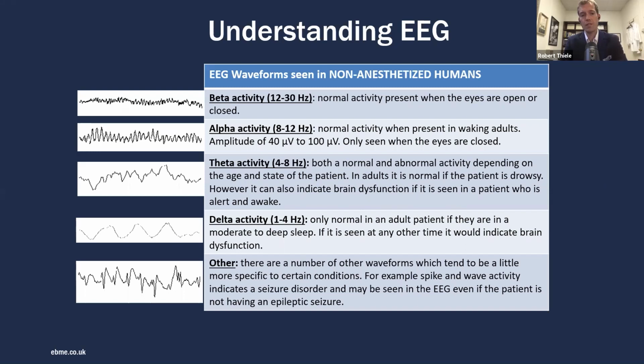It's a lower frequency. If you compare these two waveforms, you could see that the frequency at which the oscillations occur is a little bit lower here. In a tired adult, you actually get what's called theta activity, where the waveforms are even slower. And then when you sleep, it's even slower than that. And that's 1 to 4 hertz delta activity.